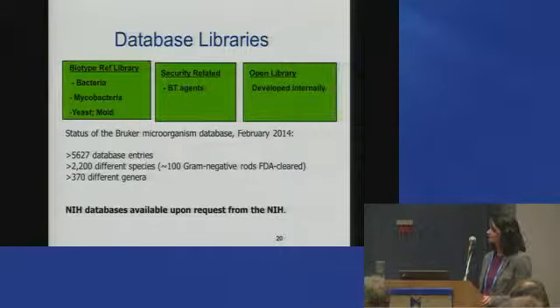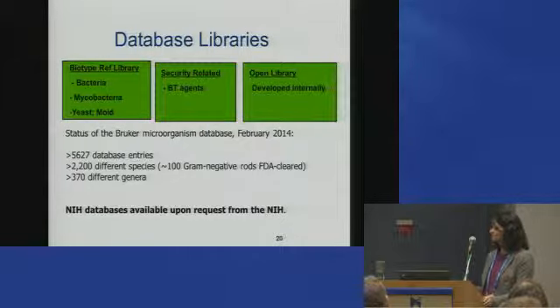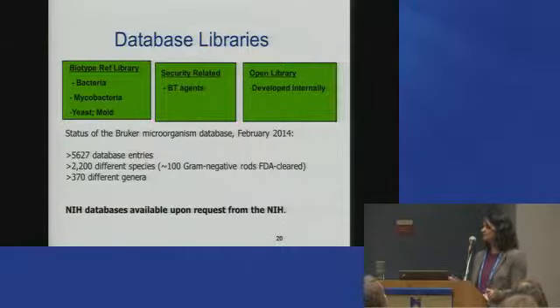So there is work to be done by any clinical micro lab that really wants to utilize this for a broad spectrum of organisms. And the other interesting thing you should know about is that it also has an open library system, which is a library that you can develop on your own if you have organisms that are not represented in the database. We've used this open library a great deal because we used to do sequencing a lot previously, as you can imagine, since we encounter a large number of organisms that, quote unquote, have not read the book, or would not pan out with any system, either by biochemical method or by nucleic acid testing. And so we used to get these sequenced regularly with different primers and so on.